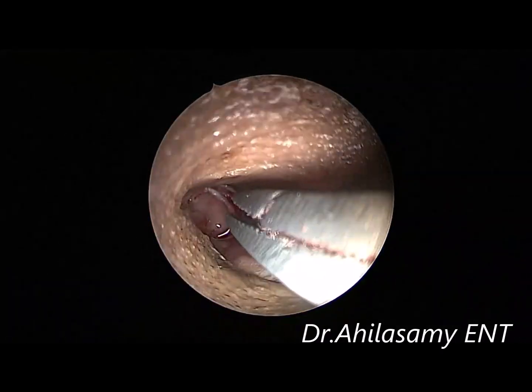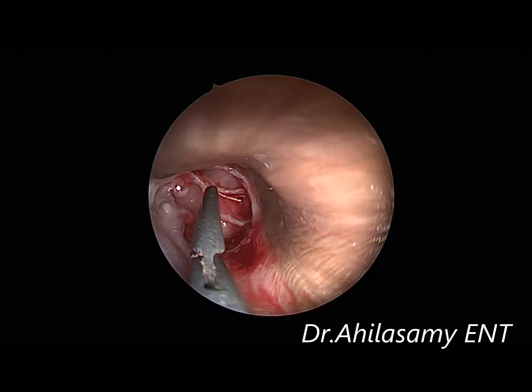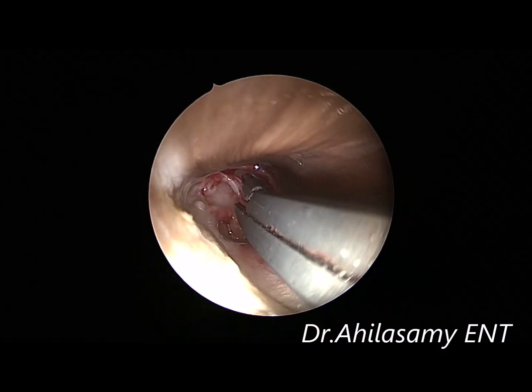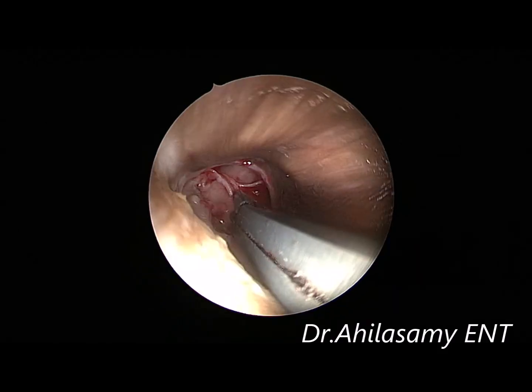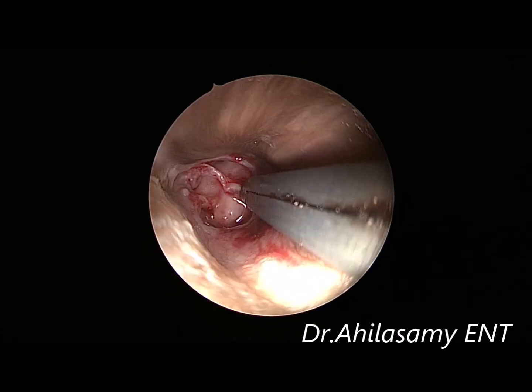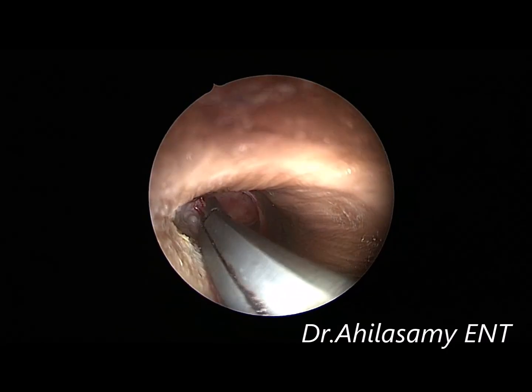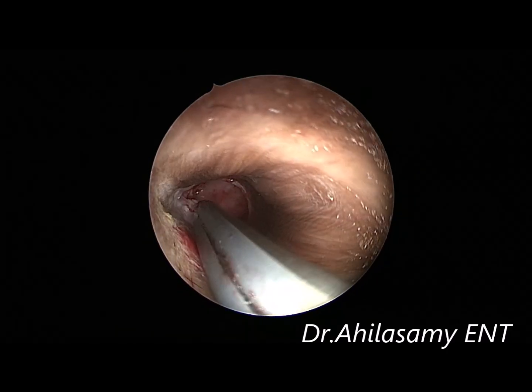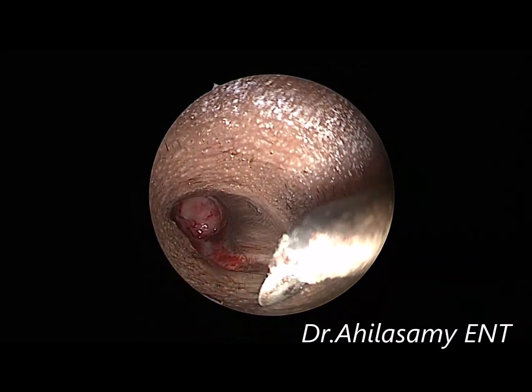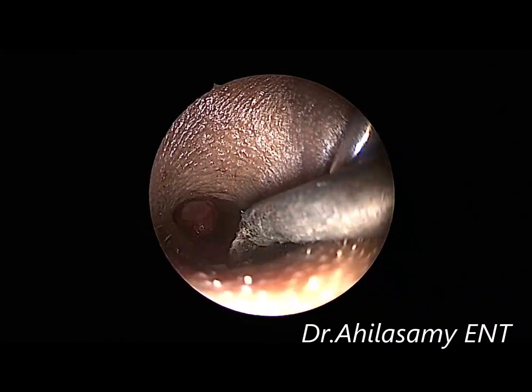Already the graft has been taken and the canal has been infiltrated. The margins are freshened in the subtotal perforation, and after the sickle knife incision — a probe incision just a millimeter away from the margin all around — the all-around thin strip of fibrotic tissue has been removed.